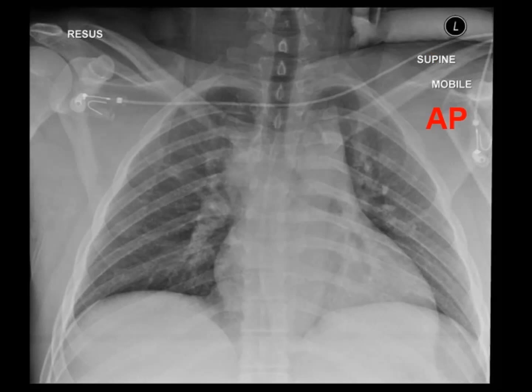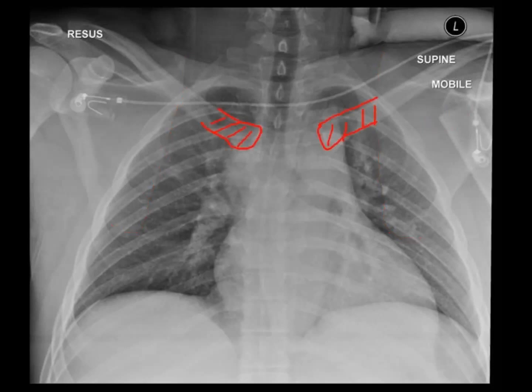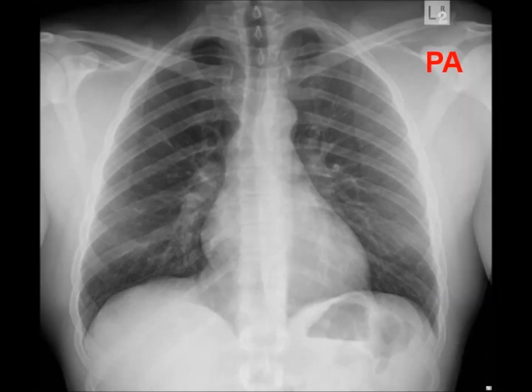Notice how in the AP projection, the borders of the scapulae are sharp and appear to lie over everything else, while the clavicles appear to be obscured by the ribs and other structures. Also notice that the heart appears abnormally wide. Secondly, you want to know the position of the patient — are they upright or lying? Hopefully this information is available.